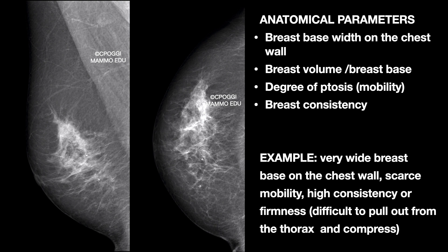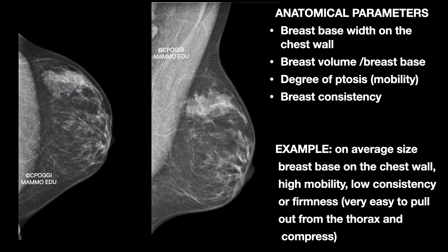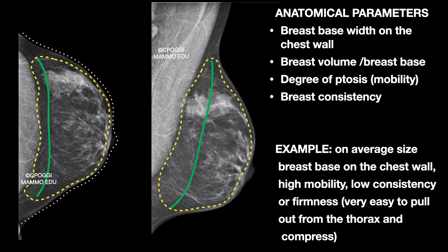Cases like this one, with a very wide base on the chest wall both in the superior-inferior and medial-lateral directions, make it very difficult to show deep planes in general and the IMF as well. These are breasts characterised by very low mobility and very high consistency, even difficult to compress properly. On the contrary, breasts like this one are highly mobile and of low consistency — very manipulatable, actually too much — so it is easy to create faults while positioning and compressing.